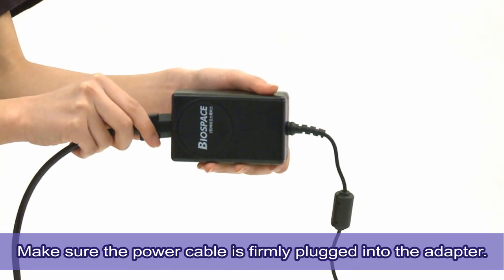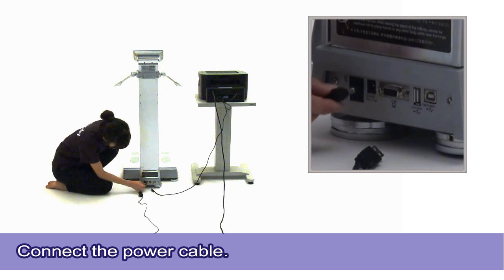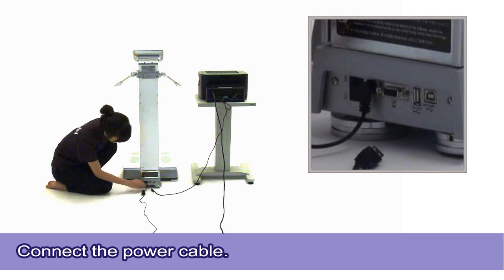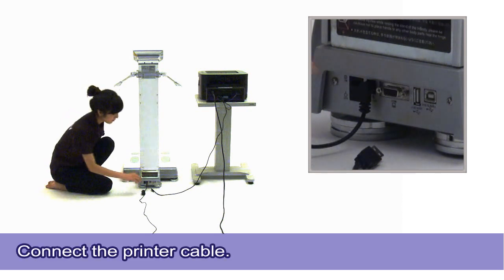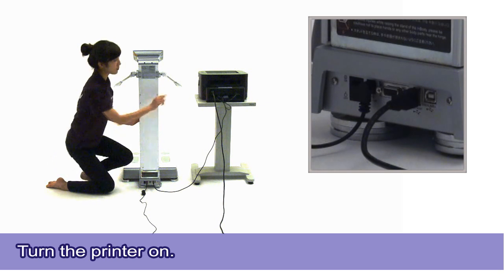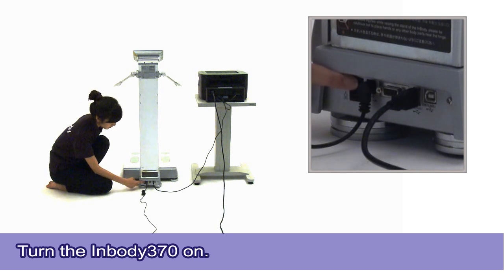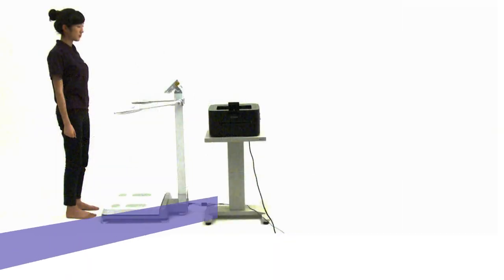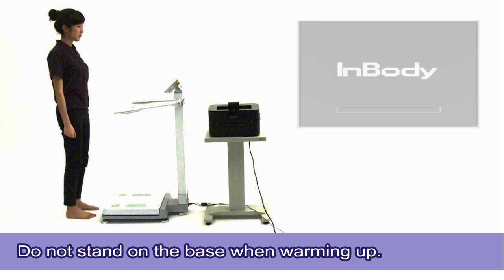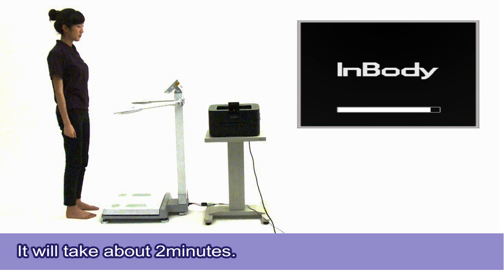Make sure the power cable is firmly plugged into the adapter. Connect the power cable into the rear panel of the InBody 370. Also, connect the printer cable into the rear panel of the InBody 370. Turn the printer on, then turn the InBody 370 on. Do not stand on or apply pressure to the base of the InBody when it is starting up. Applying any weight or pressure to the base may result in inaccurate measurements. It will take about 2 minutes.